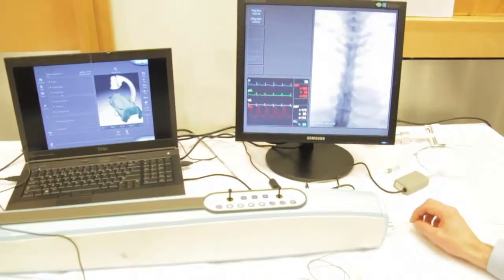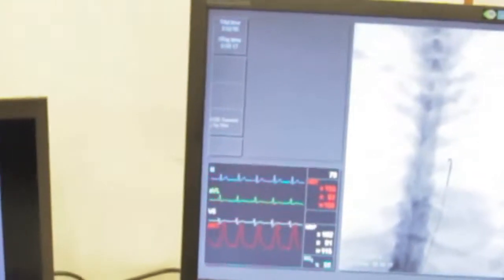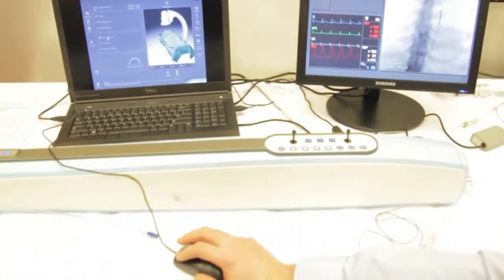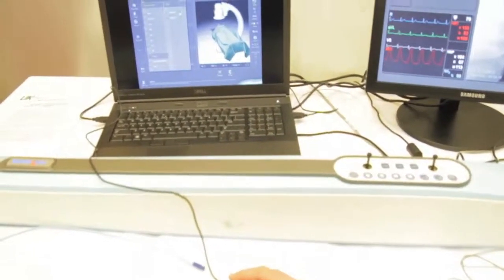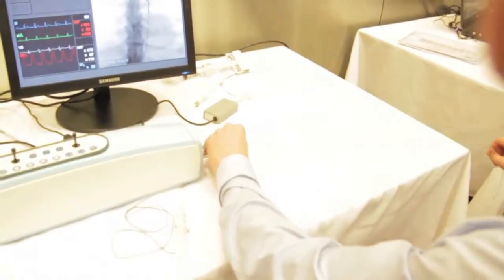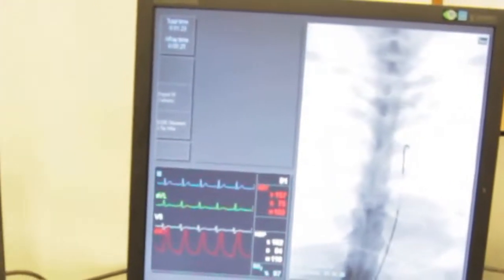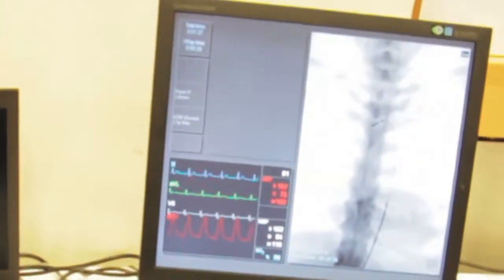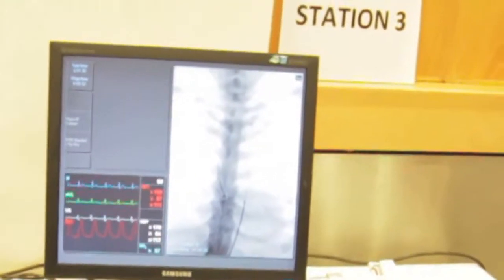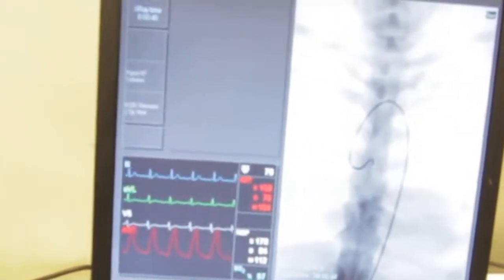We start off using a standard J-tip wire to gain safe access. You'll see the wire appear in the descending thoracic aorta. We're then going to select a catheter to do an arch angiogram — generally we'll use a pigtail catheter. It has multiple side holes, so when contrast is injected the large volume comes out through multiple side holes, making it far less likely to cause damage or dissection. We advance the catheter into the descending aorta, then advance the guide wire over the aortic arch into the ascending aorta until we're close to the aortic valve, and follow with the pigtail catheter. We reform the pigtail in the ascending aorta and bring the guide wire back.